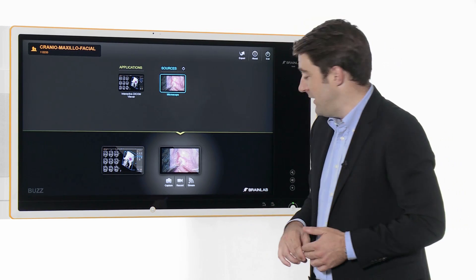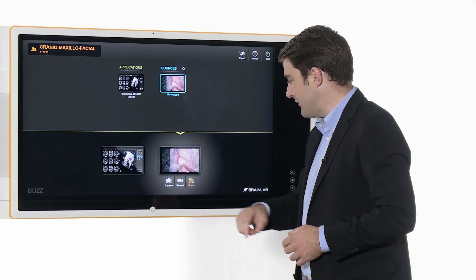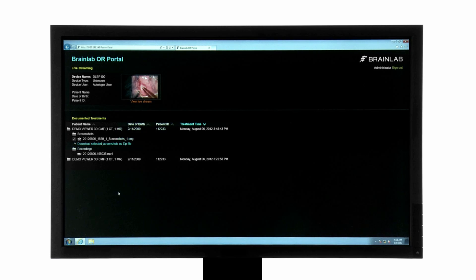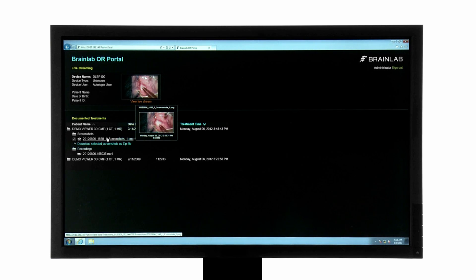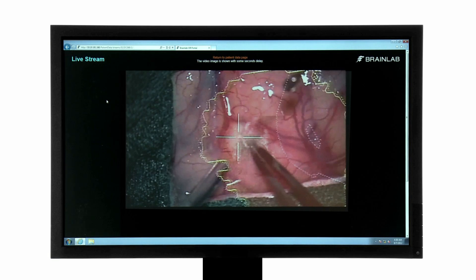At any time, an HD stream can be enabled. From any authorized workstation in the hospital, I can access these screenshots and recordings as well as the OR livestream.